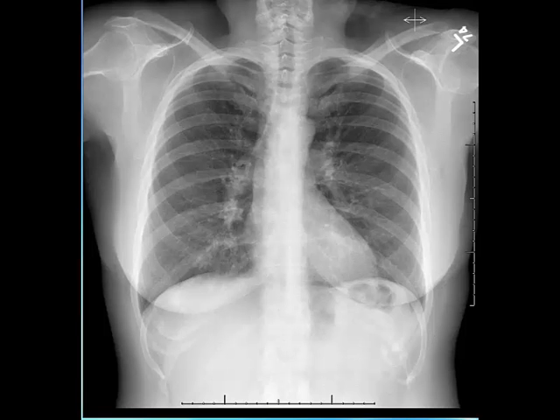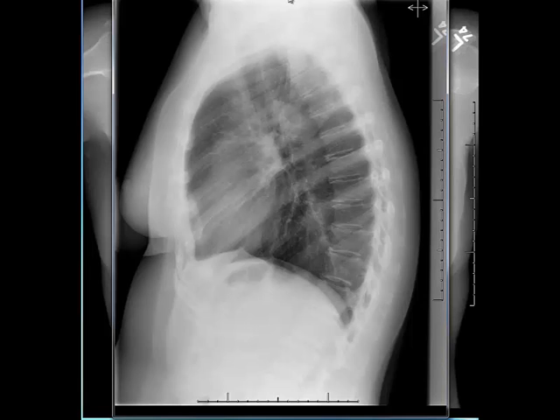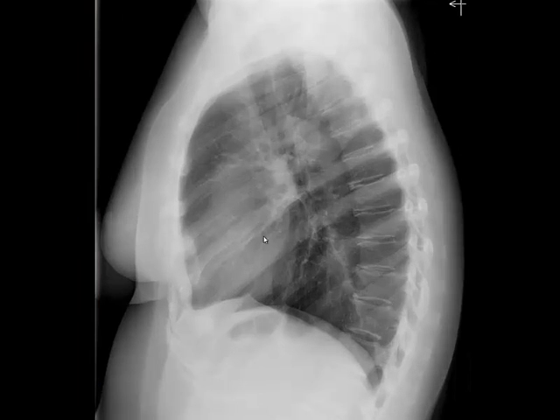Next I evaluate the lateral chest radiograph. When evaluating the lateral chest radiograph I use the same systematic method — I first evaluate the heart and the mediastinum. Normally the heart should occupy the lower third of the retrosternal space. Once I see that the heart occupies more than a third of the retrosternal space, I would suspect right ventricular enlargement.